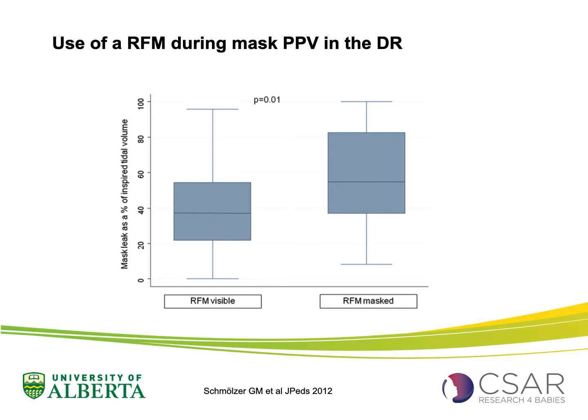Now, does the respiratory function monitor reduce mask leak in the delivery room? The answer is we don't know. Why is this? Well, I put this slide up from the first RCT on using a respiratory function monitor in the delivery room, published, and it was one I did during my PhD. What you can see is that there was a significant reduction in the mask leak, from around 54% as median to around 37% median, which is nice.